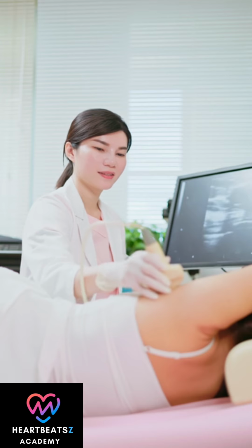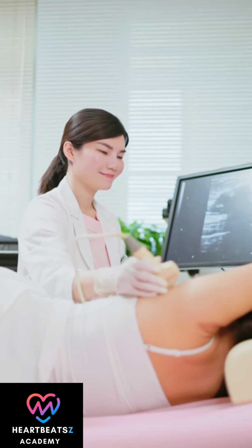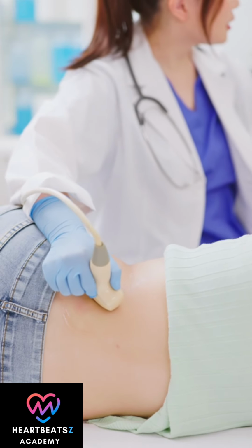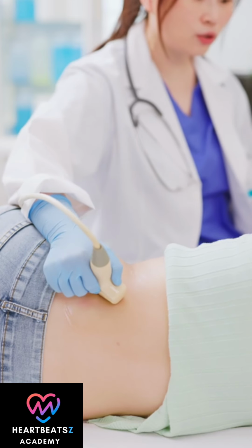At its core, ultrasonography operates on the principles of sound wave propagation and reflection. A transducer, a small handheld device, emits high-frequency sound waves, typically 2 to 18 megahertz, far above the range of human hearing, into the body.